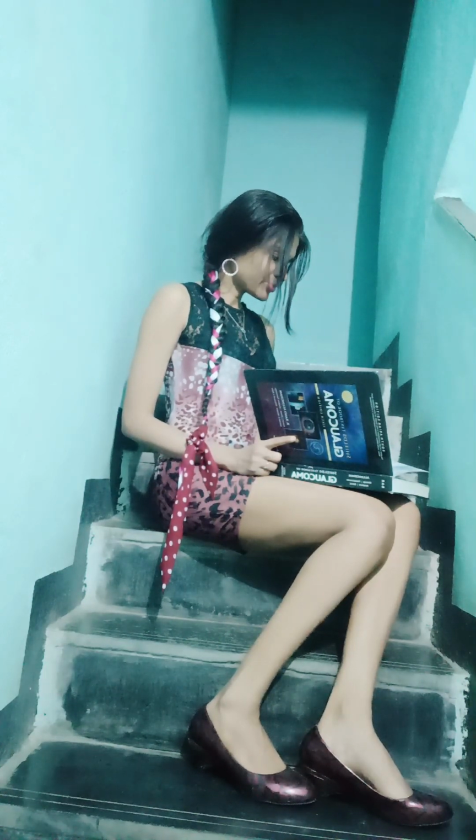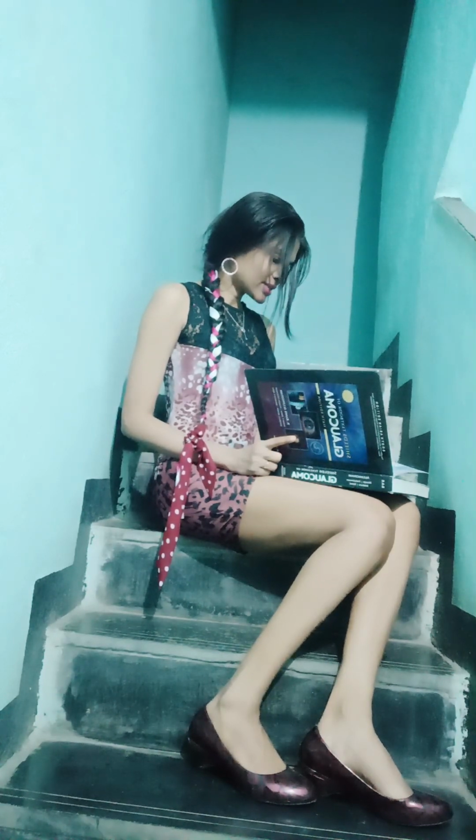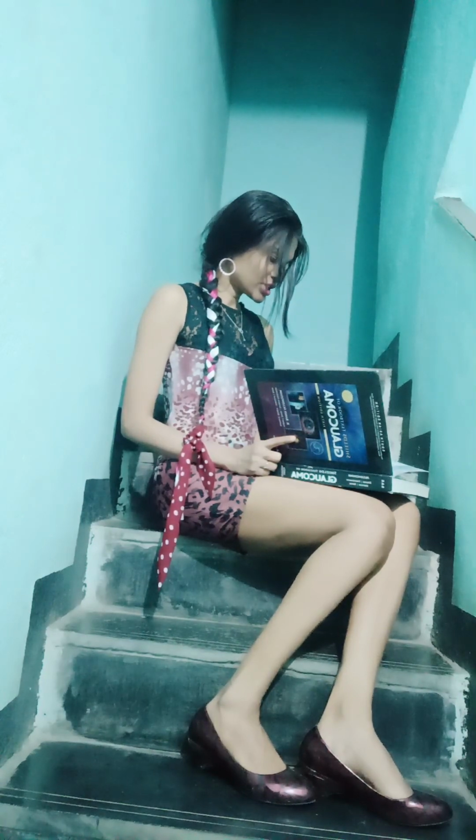Occasionally, an assistant may be needed to move the gonio lens to the desired position. Alternatively, a gonioscope with a mounted light source may be used, which allows the examiner to control the gonio lens with the other hand. In either case, the examiner scans the anterior chamber angle by shifting his or her position until all 360 degrees have been studied.